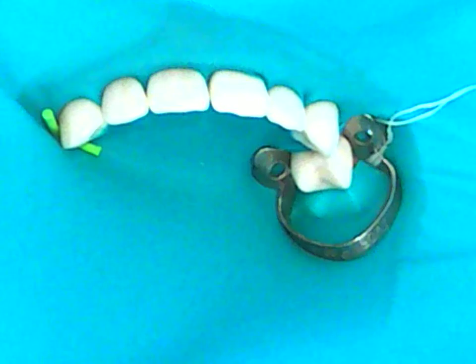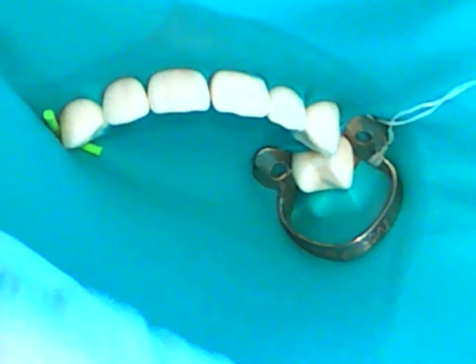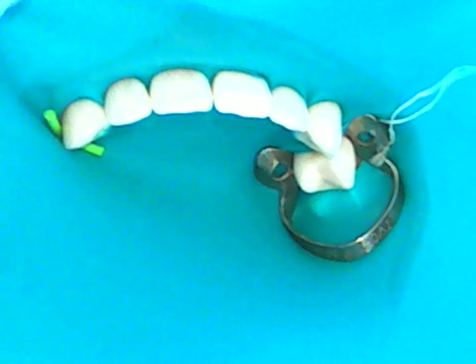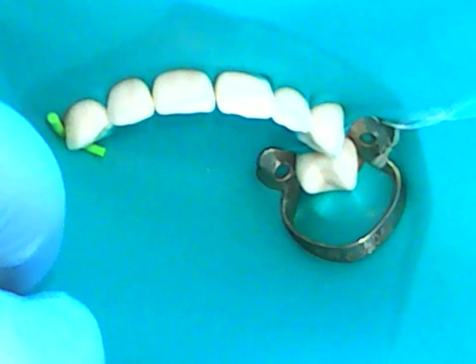And to conclude the application, we want to stretch and secure the attached dental dam onto the frame. So originally I just put it on the four corners. I'm going to stretch. Again, you can't see this, my apologies, but it is on the other videos. And that concludes the application.